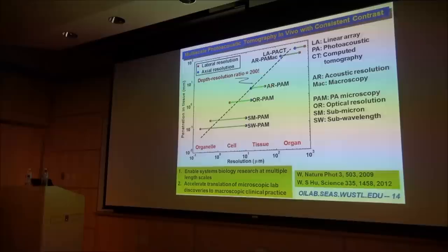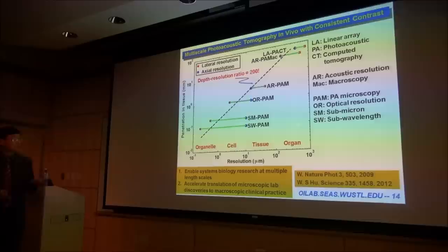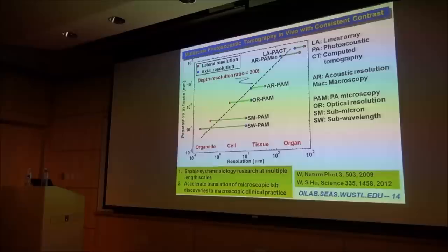If you look at some of the other scalable high-resolution modalities, you roughly get the same number. Like OCT, for example, penetrates about a millimeter. It gives you about 10 micron resolution. Divide the two numbers, you get about 100 as well.